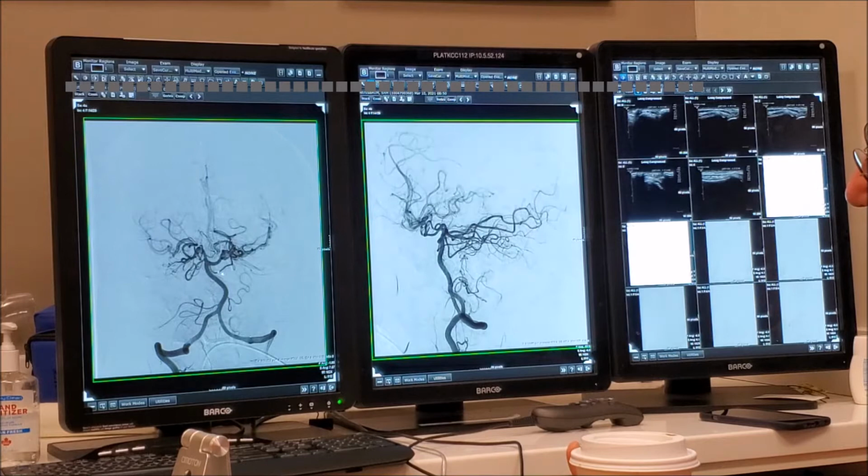Then I try to see in the next collateral, the superior cerebellar, and you see there's also a discrepancy of the superior cerebellar artery. This has to compensate with more territory, because here is more dominant. So it's always a balance, and that's how we try to make it. Plus, he's got a peculiar thing at the basilar bifurcation, where the dominance occurred from this branch. So almost all, if not the main perforators that will go to the midbrain and so on, will come from the right P1.